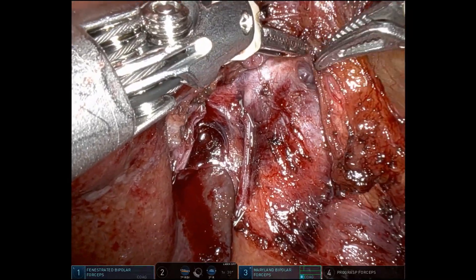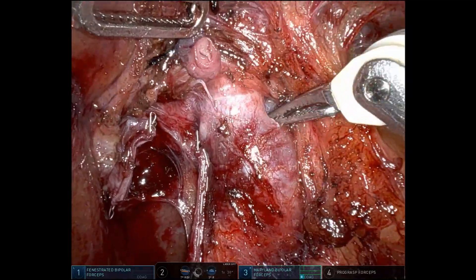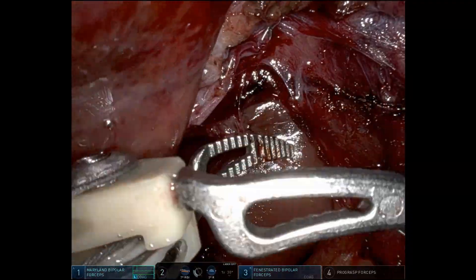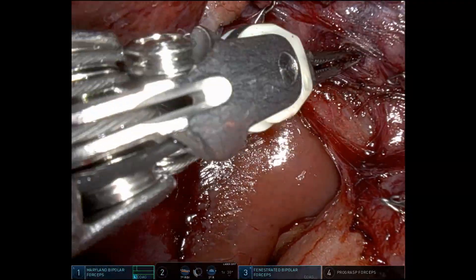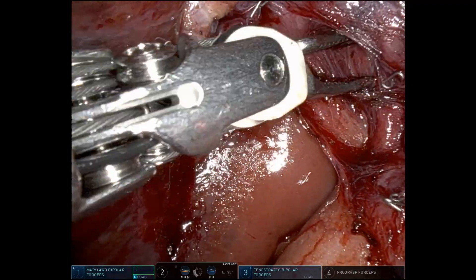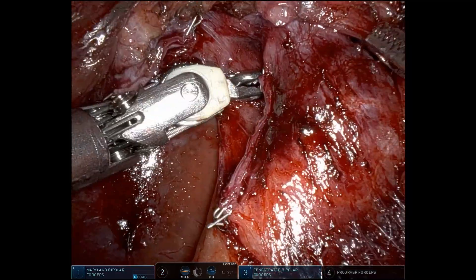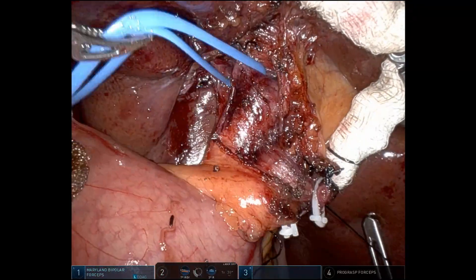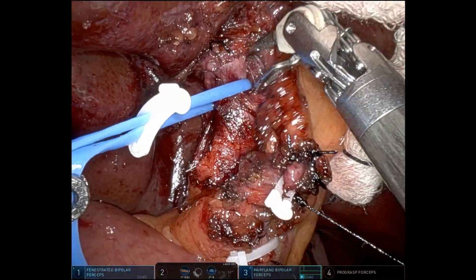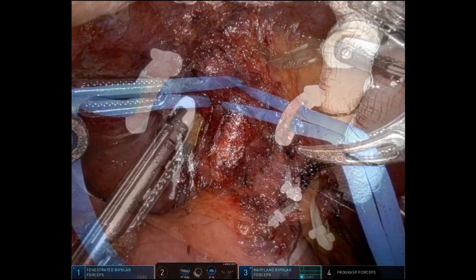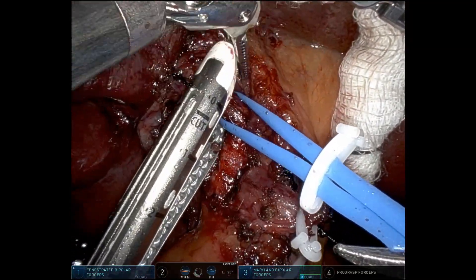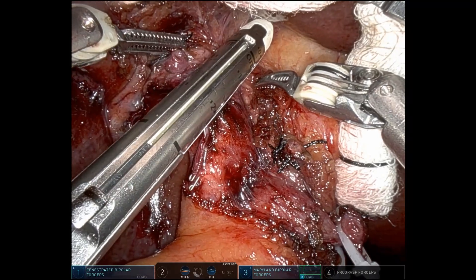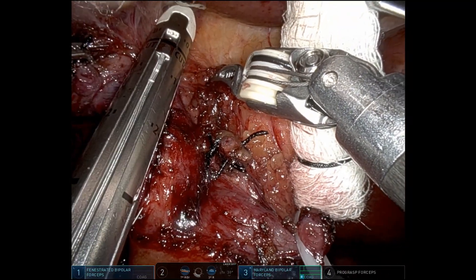Now we're going to work on isolating and then dividing the right anterior portal pedicle. More pinch burn. You can see I switched the Maryland to my left hand because there was better access here posteriorly. Same thing — vessel loop to control the structure. This also helps with making sure you have enough space to place the vascular stapler. We're pulling down on the structure that we want to protect, which is the main and the left portal vein, to give us additional space to divide with the stapler and make sure we're not narrowing the left portal vein.